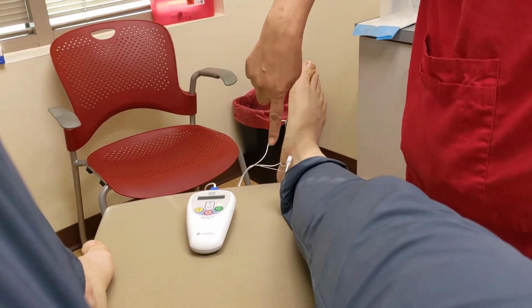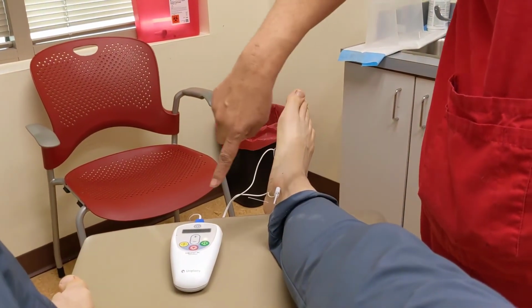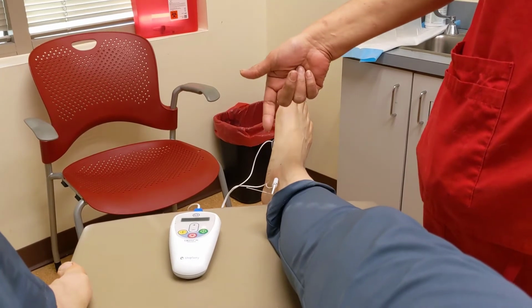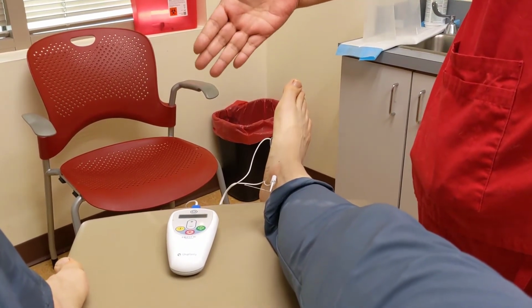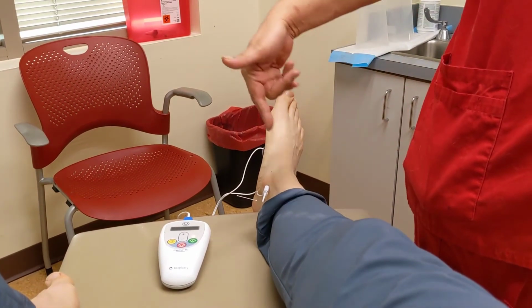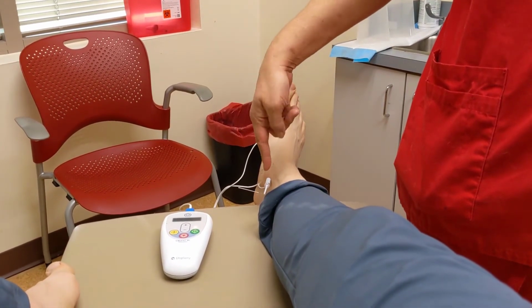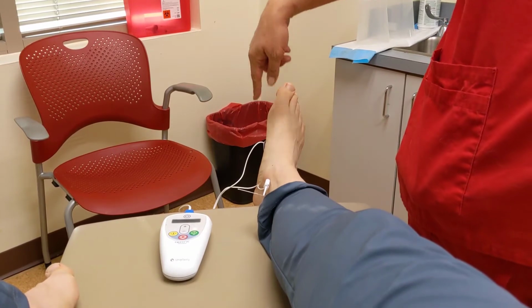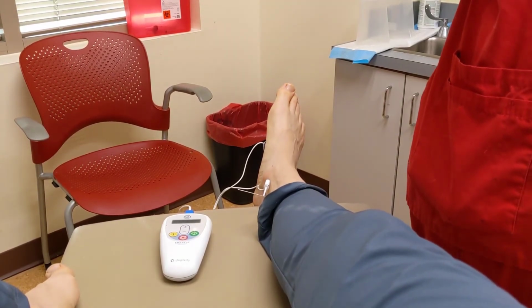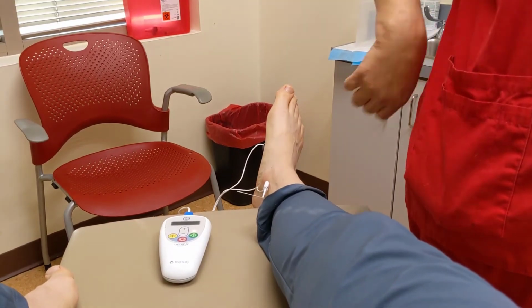Well, I call this the acupuncture needle, and I call that a TENS unit because that's essentially what it is. Yeah. And so rather than putting the TENS unit pads on the outside, this is stimulating the nerve that runs here, down your foot, back up your leg to your bladder, and it stimulates the bladder internally versus externally. Okay, good to know. So it's really interesting.